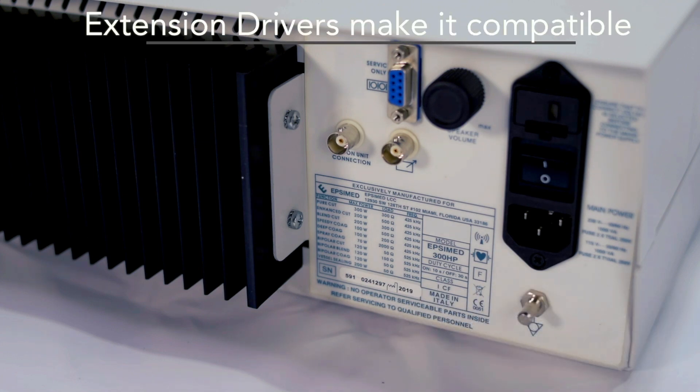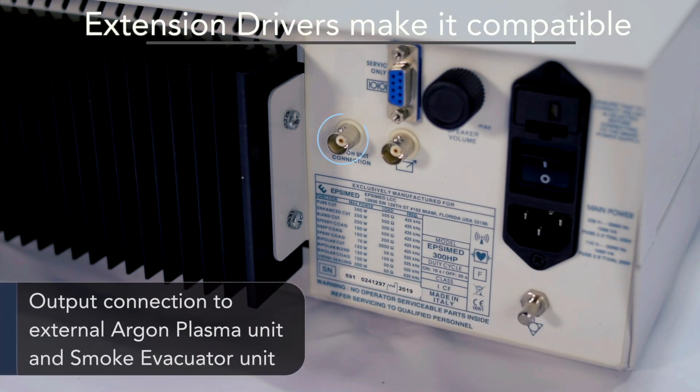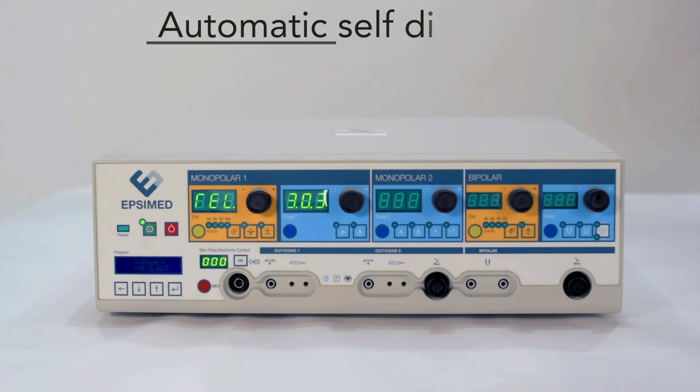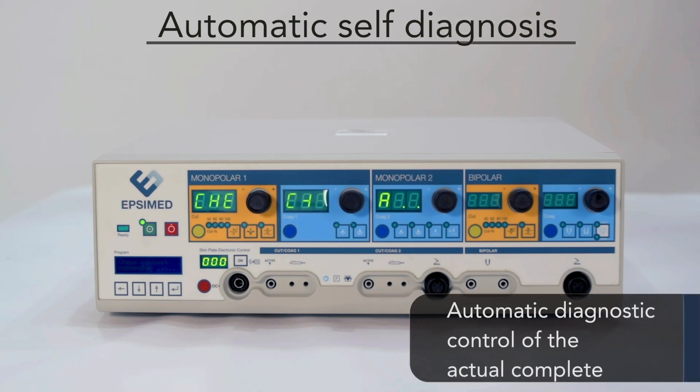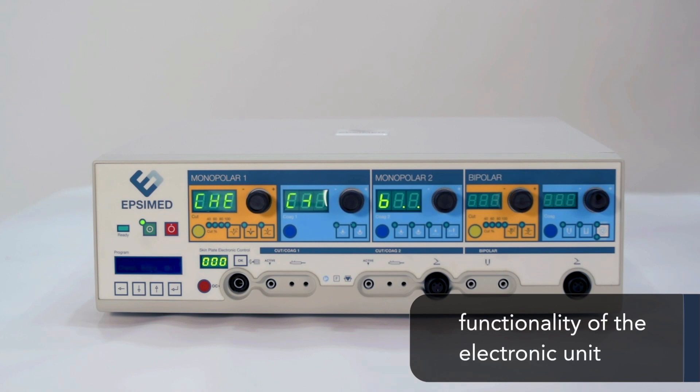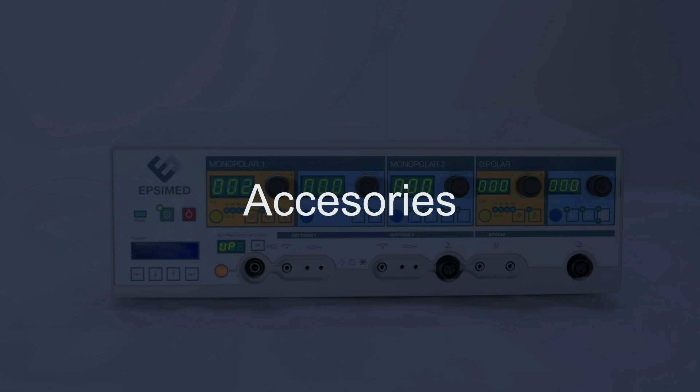Extension drivers make it compatible for output connection to an external argon plasma unit and smoke evacuator unit. Automatic self-diagnosis provides automatic diagnostic control of the actual complete functionality of the electronic unit. The standard configuration includes these features.